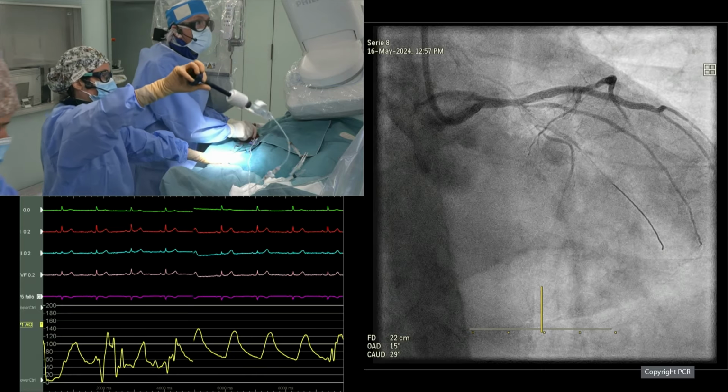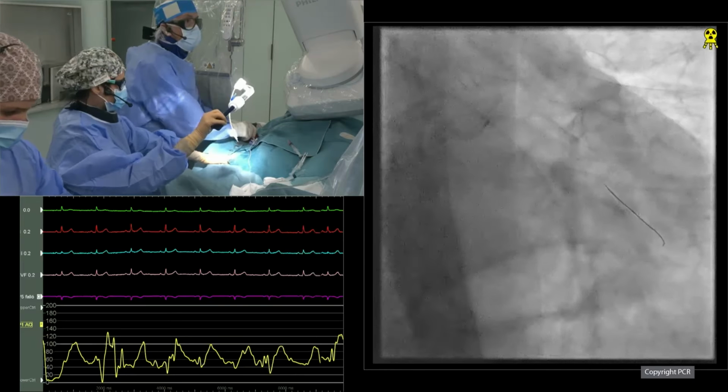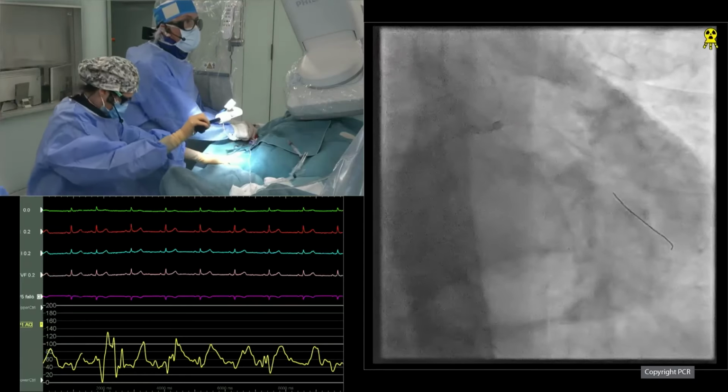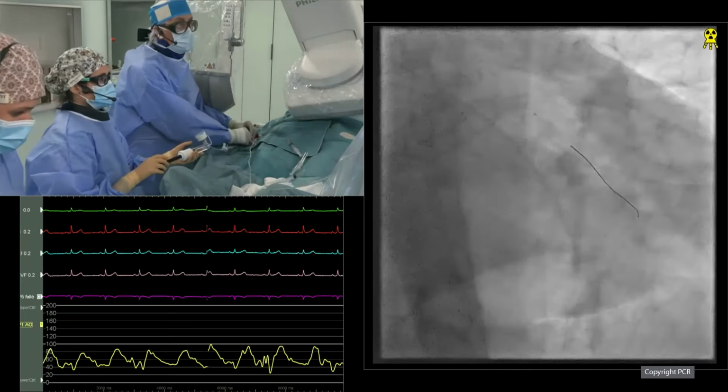Well, I think at the higher speed, you're increasing the radius. The crown is orbiting, so your penetration into the tissue will be deeper. I also think because you're going at a higher speed, your effect on hitting the vessel, hitting the calcium, will be harder. So you're getting sort of two penetration, this extra sanding, deeper penetration and perhaps more fracturing ability.